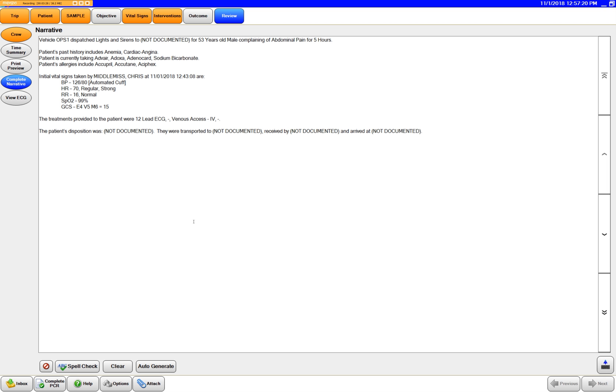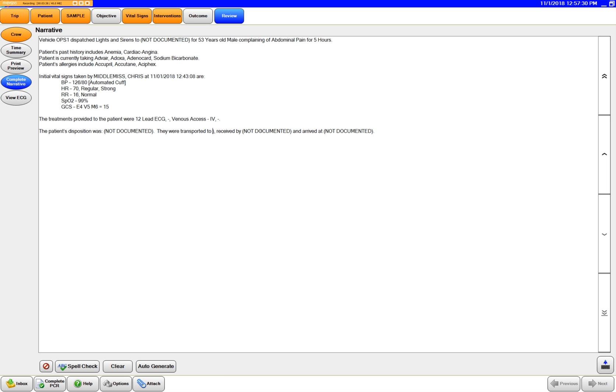Do you have anything to add Dan? Just if you don't want to document where it says not documented, you can just highlight it and delete it. Oh okay, so just do that. Awesome.